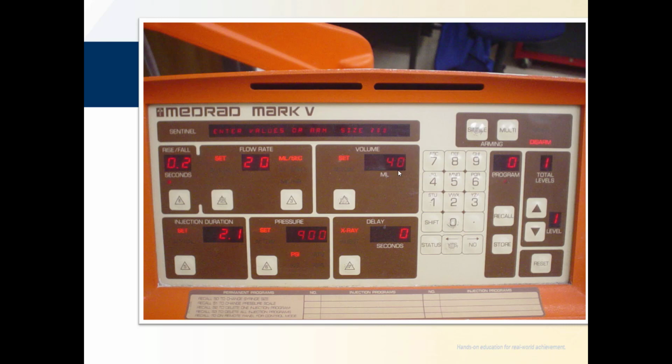Remember, a milliliter and a cubic centimeter are interchangeable units. And then because of this selection that we have right here, the injection duration, it's telling us it's 2.1 seconds. And you would think 2 seconds with 20 mLs per second for a total of 40 mLs, but we have this rise fall. So it adds 1/10 of a second to it.